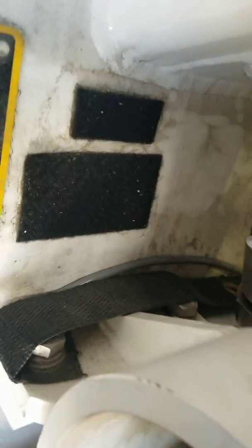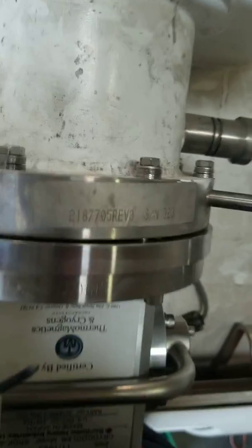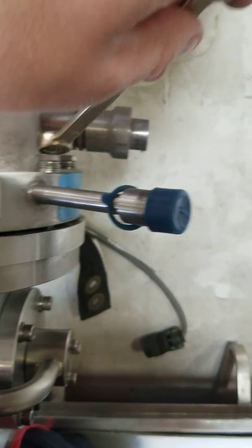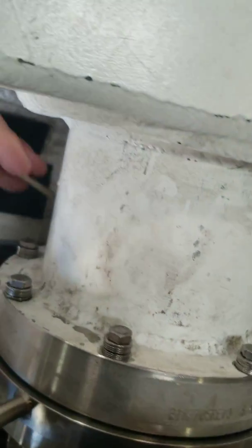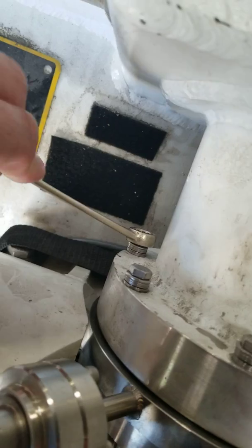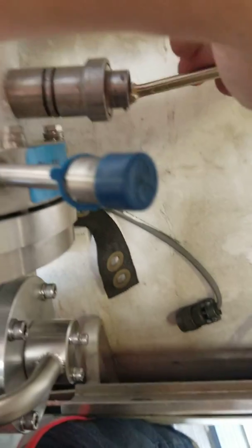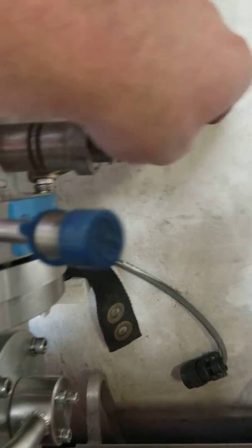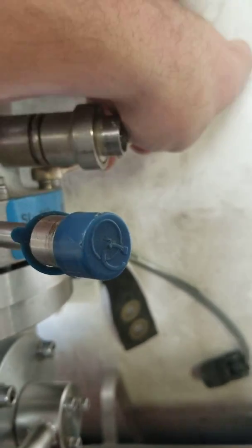And then you're going to go in a star pattern, which means go opposite of where you're at. So same thing, maybe 20 foot-pounds, and then we just did that one, the next star pattern. You switch back and forth, and at the end you just want to close the space. You don't want to crank on it. Very important that you don't crank on it. You risk damaging the magnet if you crank on it too hard. Just closing that space, that little gap, we're closing it.